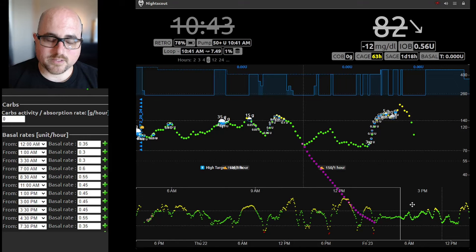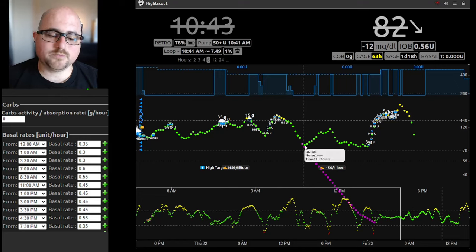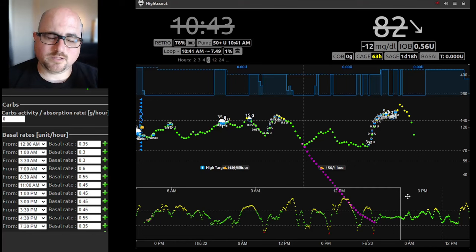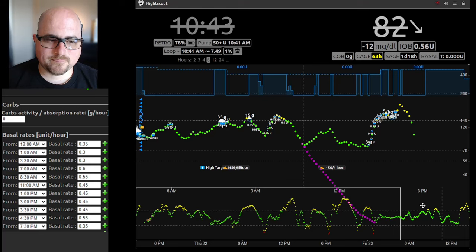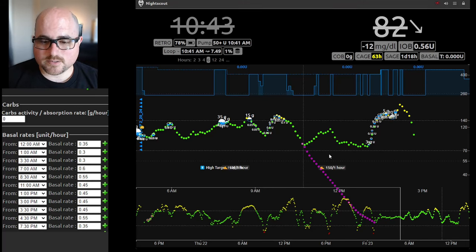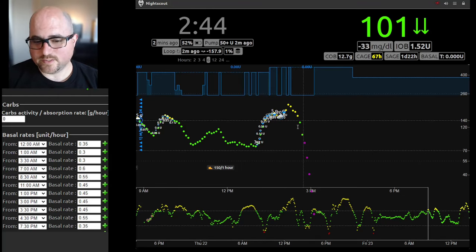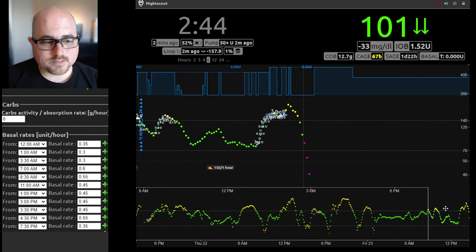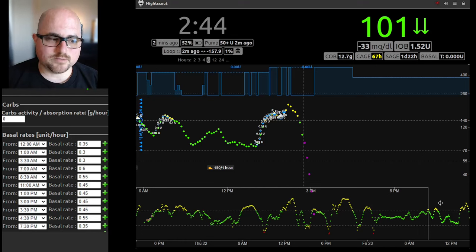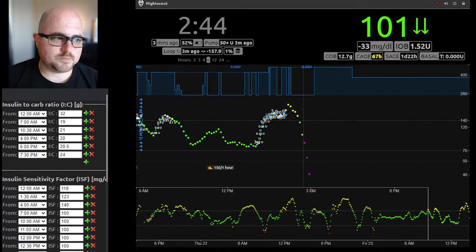I have a question: was this treated or was this fine on its own? This would be around 145. That was not treated — he came from recess and then sat down. Not too bad. I would usually see a lot more crashing than this. This might be what's happening right now, unless the sensor is going bad — because this can be kind of dramatic as well. This can also be insulin sensitivity; there are other reasons why all this dosing happened when he went up and came back down. This morning looks fine. Sometimes you can balance a high basal with food, so let's take a look at carb ratios and see if you're doing something to compensate for that.